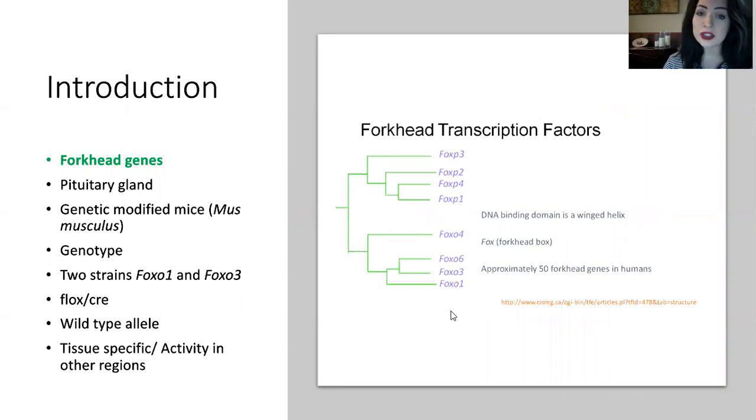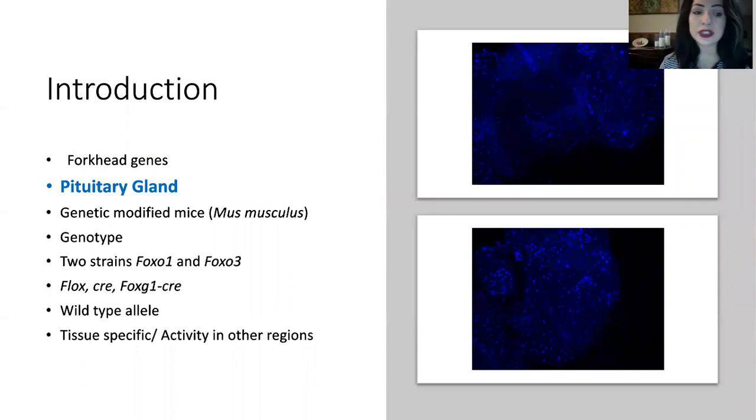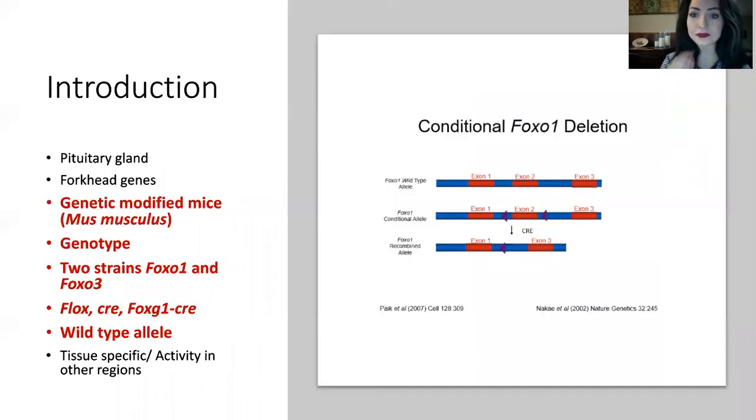They also aid in the role of somatotroph differentiation, which basically tells a cell to be a cell. They also both show expression in the pituitary gland. I've inserted an image here of my immunohistochemistry, and I won't dive too deep into what IHC is for time concerns, but basically with fluorescence, we're able to highlight the expression of FOXO1 in this pituitary gland here.